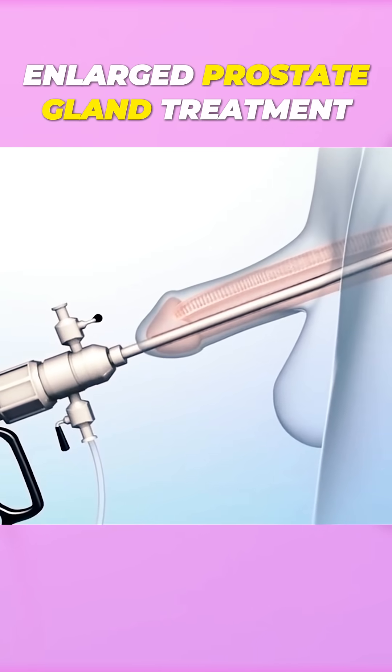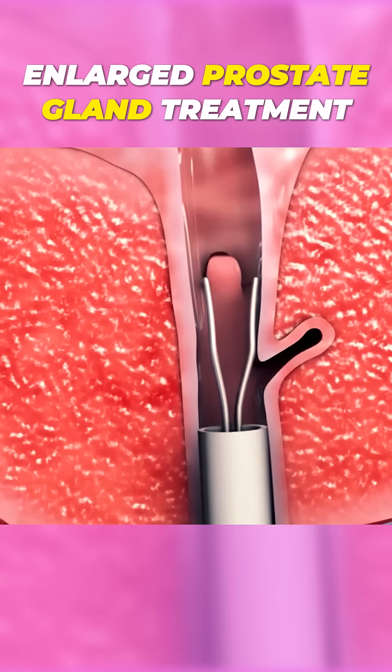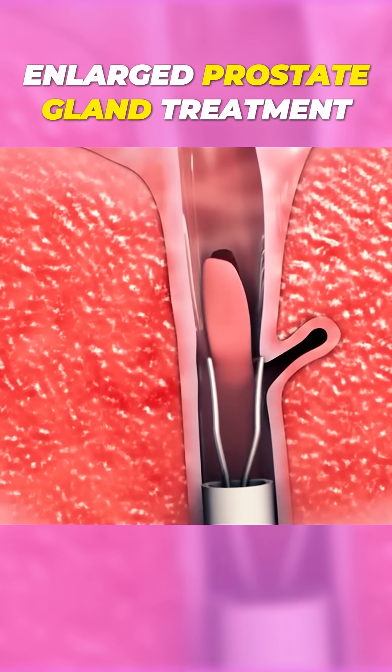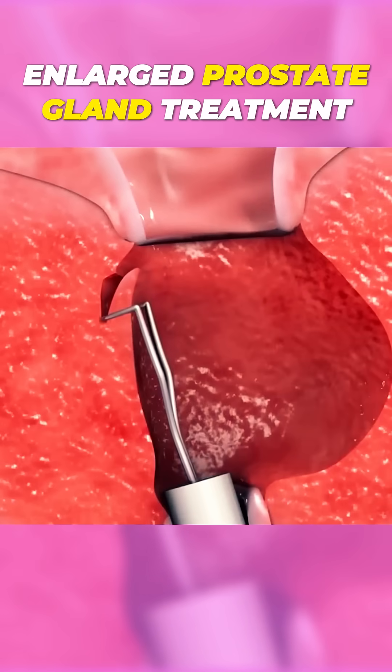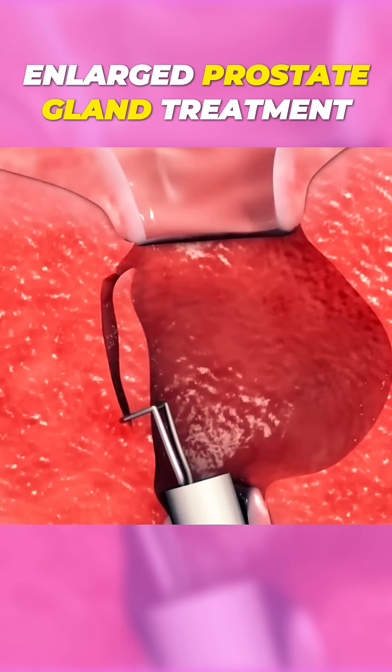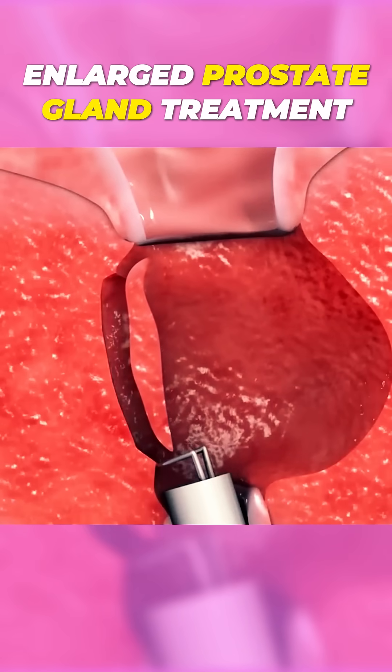To treat enlarged prostate gland, your surgeon will insert an instrument called a resectoscope through your urethra to reach your prostate. Then, a wire loop at the end of the resectoscope will be used to shave off tissue, which will widen your urethra.